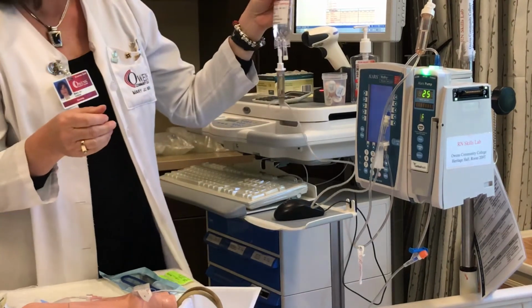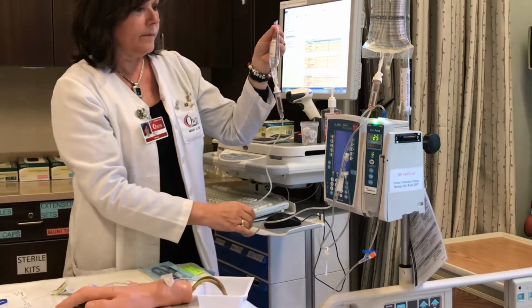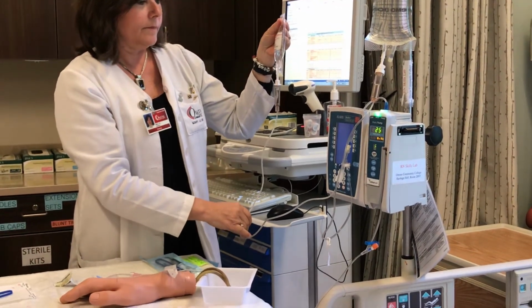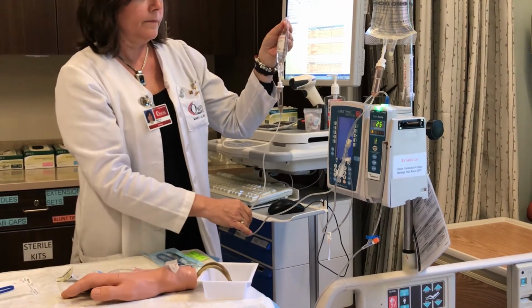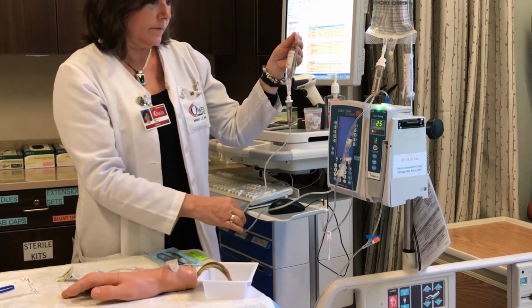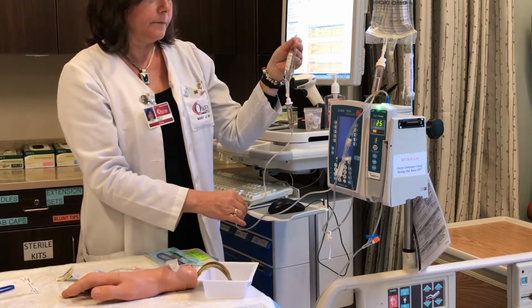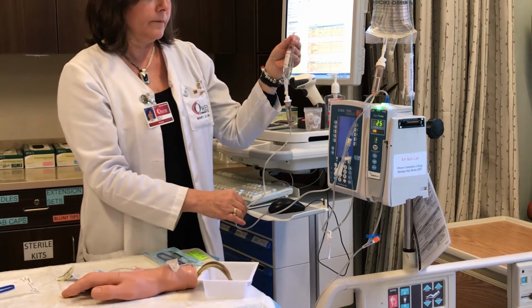After attaching the IV piggyback tubing to the primary IV tubing, prime the piggyback tubing using aseptic technique. May also straight prime, however, do before attaching IV piggyback tubing. Do not lose medication while priming. Mary Jo will demonstrate back priming first and then demonstrate straight line priming. You can choose to straight line prime or back prime the IV piggyback.